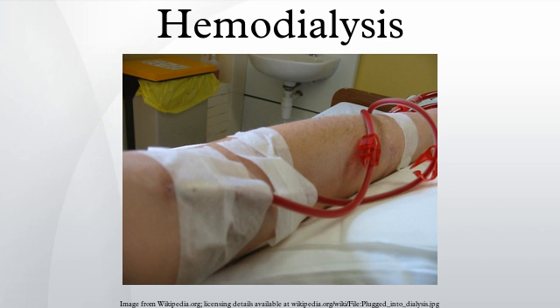In hemodialysis, three primary methods are used to gain access to the blood: an intravenous catheter, an arteriovenous fistula or a synthetic graft. The type of access is influenced by factors such as the expected time course of a patient's renal failure and the condition of his or her vasculature. Patients may have multiple accesses, usually because an AV fistula or graft is maturing and a catheter is still being used. The creation of all these three major types of vascular accesses requires surgery.